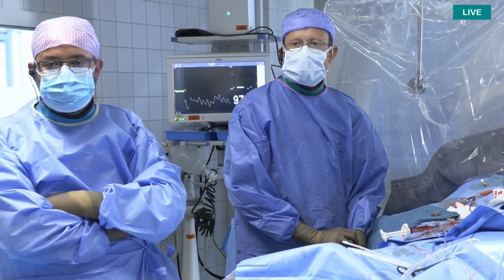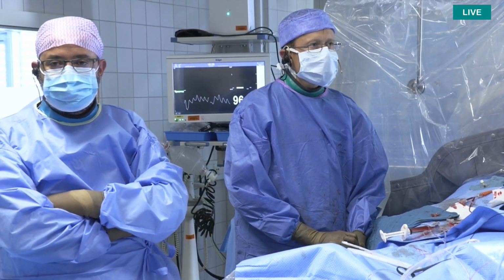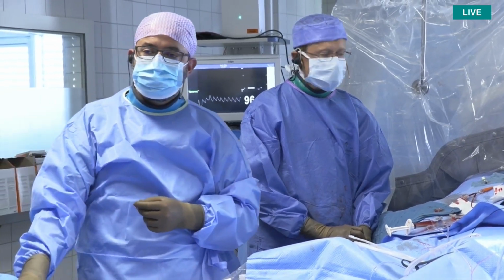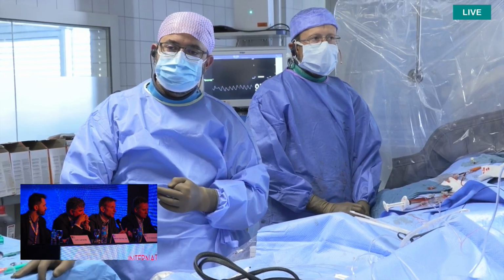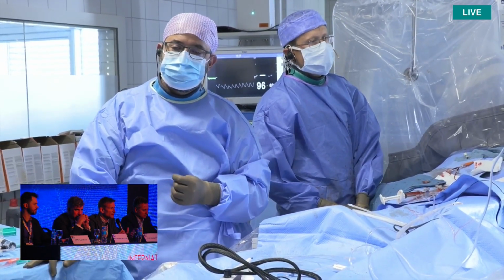Maybe just, I'm not a PCI expert, but just a question relating to TAVI. What could a CT add, if you would have a cardiac CT or a coronary CT here? Could that add something to your decision on whether rotablation is relevant, or maybe some other calcium modification technologies? Could that help or not?